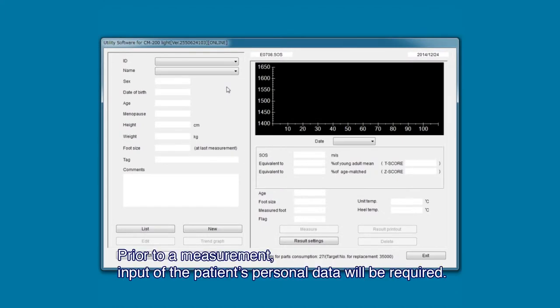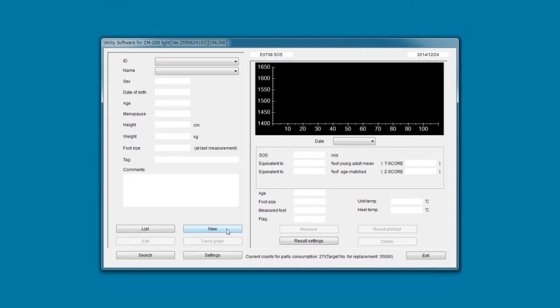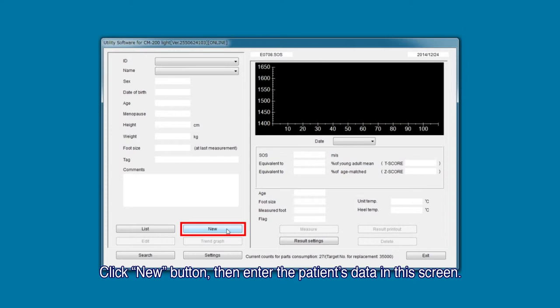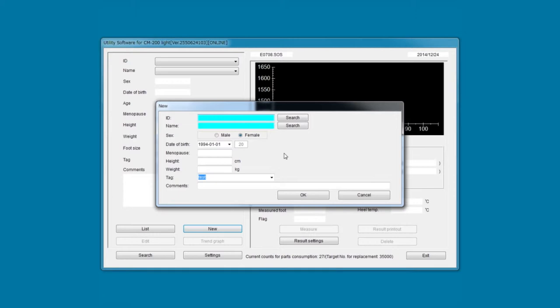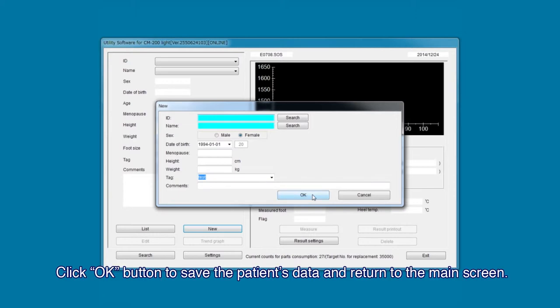Prior to a measurement, input of the patient's personal data will be required. Firstly, click the New button, then enter the patient's data on this screen. Click the OK button to save the patient's data and return to the main screen.